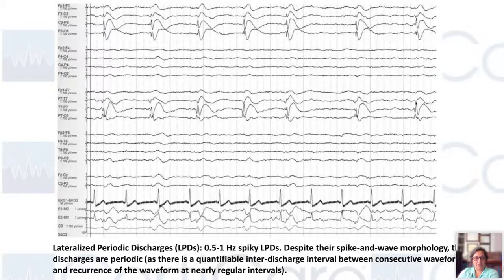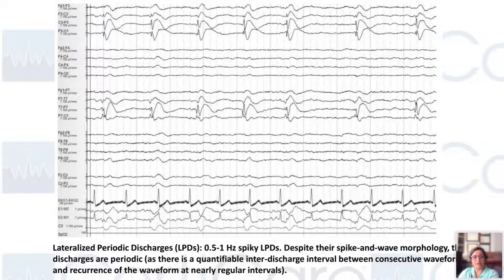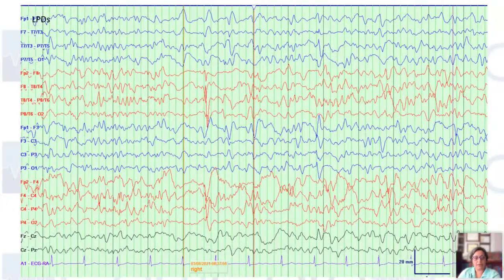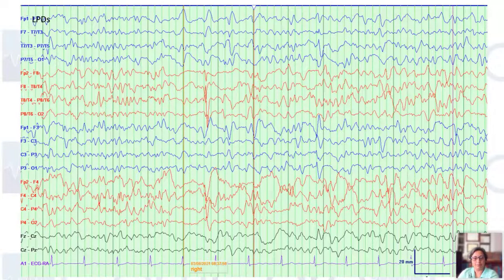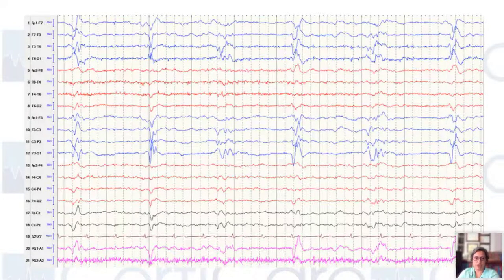Here is a left-sided 0.5 to 1 hertz example — spike and wave, but defined as discharges because of the inter-discharge interval. They are not happening in clusters, so we are not going to classify them as spike and wave. These are spike and wave lateralized periodic discharges on the left side. Another example is maximal on the right with some spread on the left. These LPDs are with faster frequencies, so they will be classified as LPDs plus F.